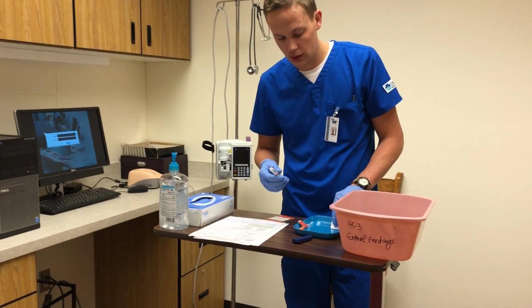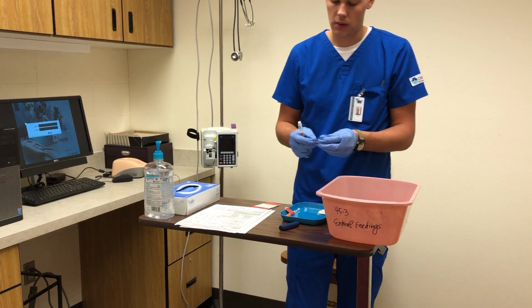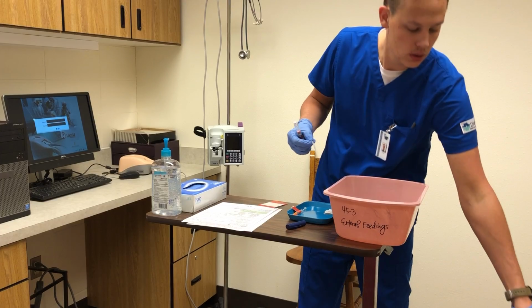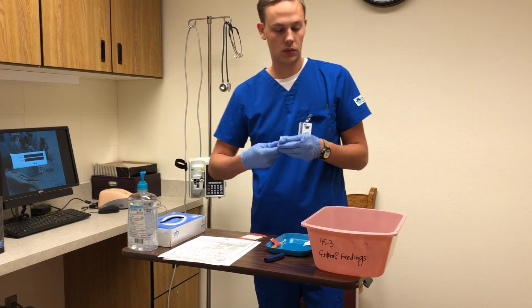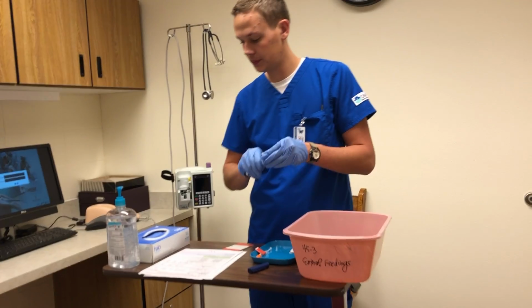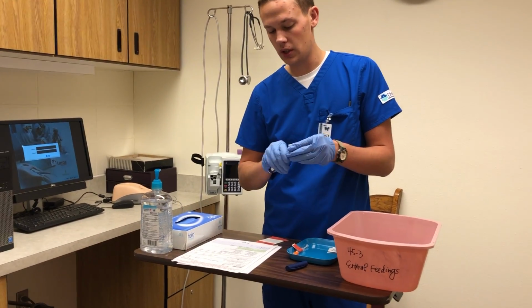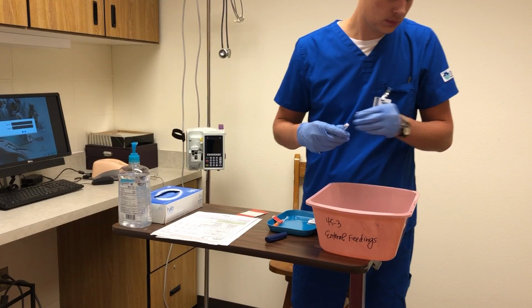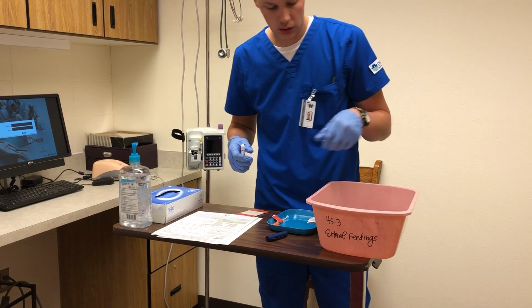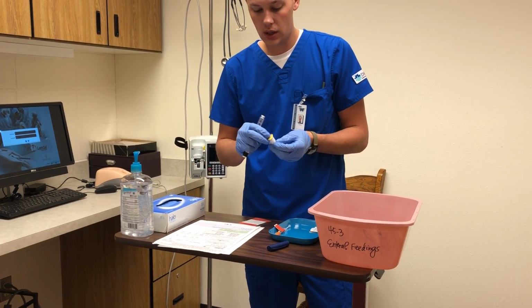So I know that this is the right one. So I'm going to take the lid off, and I'm going to wipe down this part. About 10 to 15 seconds. Okay, so that's done. And then here's the needle for it.